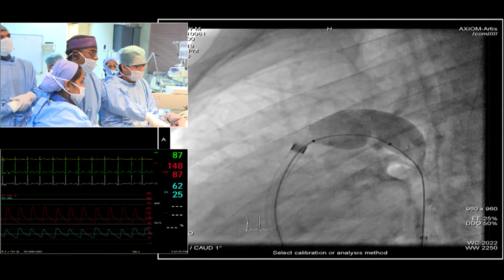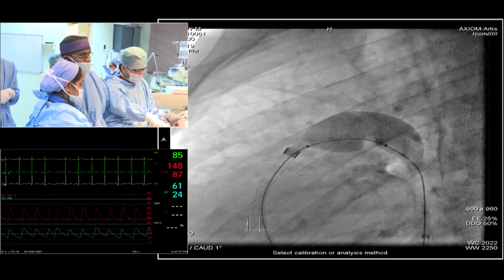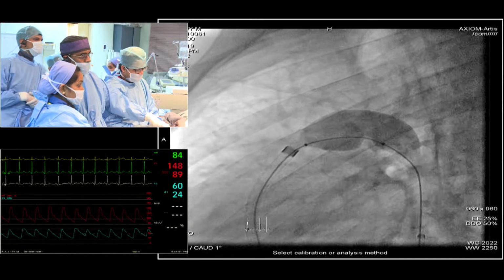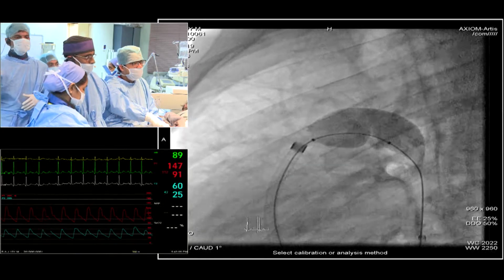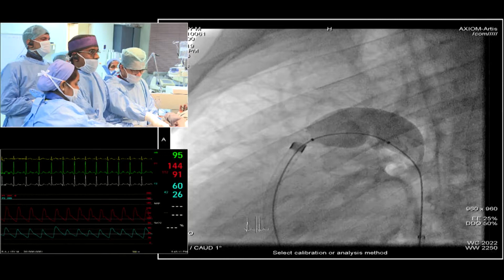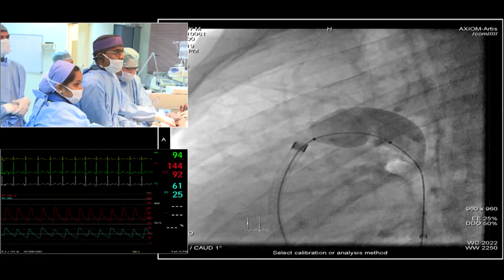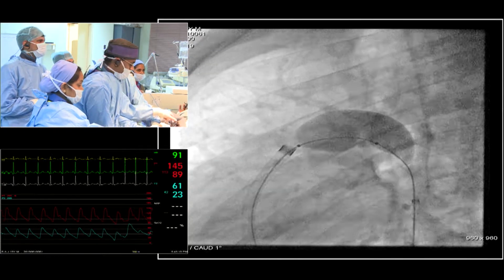But you have a chance for treating them with pulmonary specific drugs afterwards. Now, if the drugs are working, then you have shunt, and if the drugs are not working, then you don't. Then the shunt becomes right to left. Then it's too big. There it goes. It looks like you've occluded it. Yes, it looks like you've dropped to less than half systemic on your PA pressure. Correct.